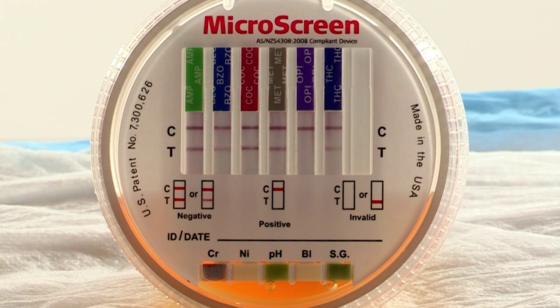Now, the other test that we are carrying out in this lid is at the bottom of the lid, you can see some colour boxes. That is where the specimen integrity is being tested for, or whether somebody has tried to beat the test by cheating, such as drinking a lot of fluid prior to the test, taking some agent that's going to theoretically flush the drug out of the system, or adding something to the sample. If any of those practices have been undertaken, then one of those colours will be abnormal.